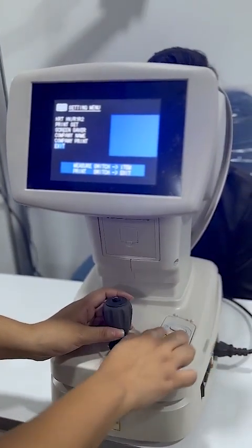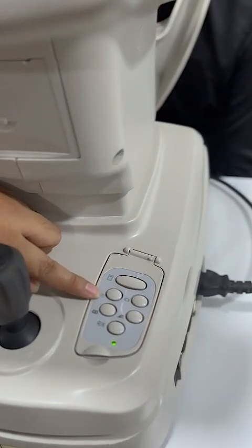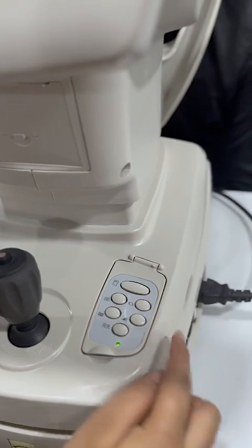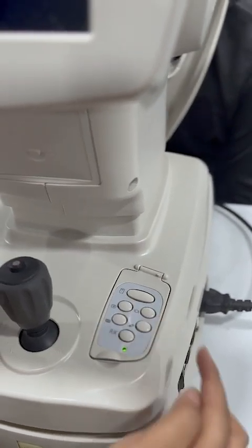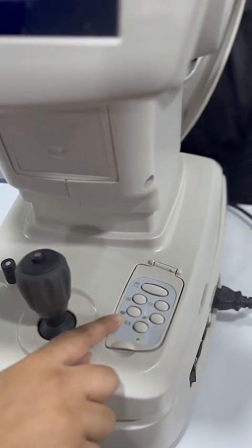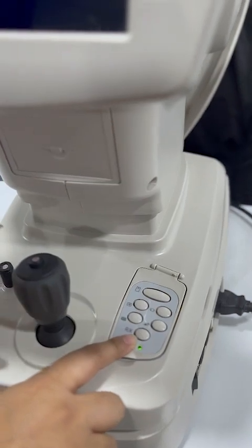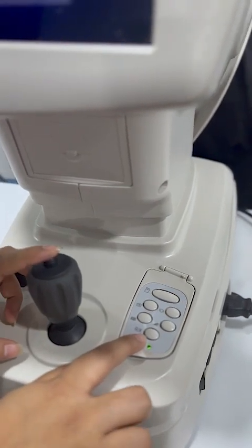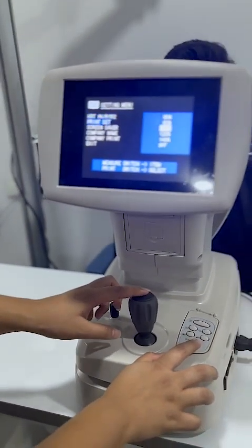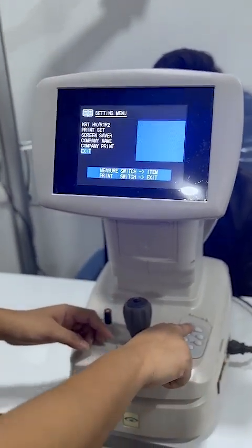Now I will tell you the buttons on the front. This button is for printing. This button is for when the patient has already had cataract surgery — you can select this and it will take the reading accordingly. This button is to clear. And this is for the record data of the previous 10 patients saved.